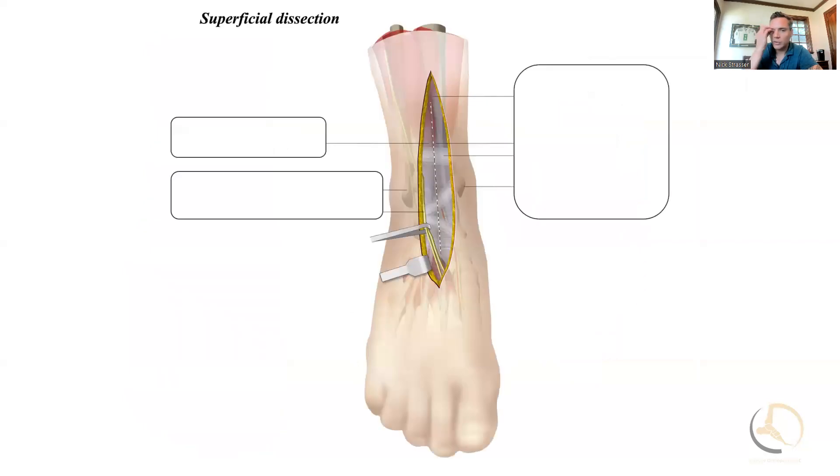This is what you're looking at: you have the SPN at the distal aspect of the incision kind of trailing into the wound. You do want to be careful to protect it and dissect it free so you don't cut it, particularly if you're coming in and out with saws as in an arthroplasty.